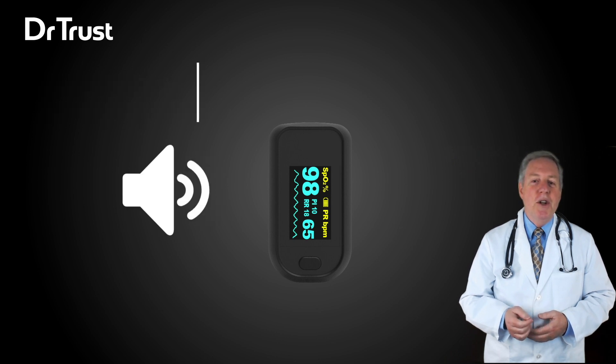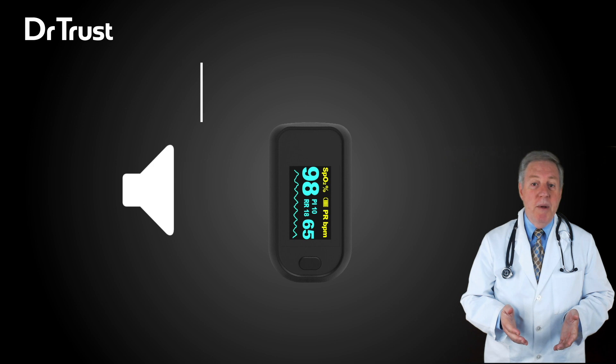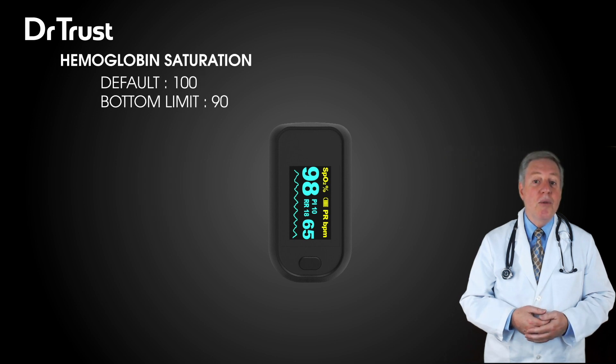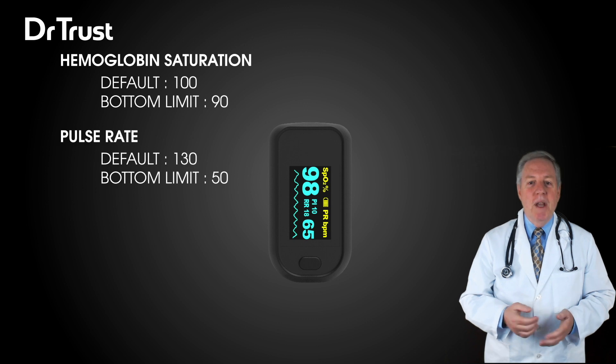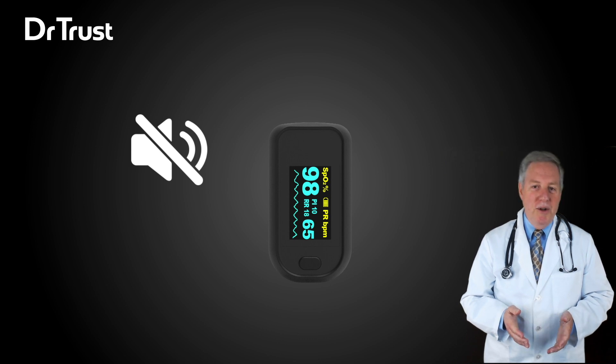It includes a visual alarm function for real-time spot checks. The default upper limit for hemoglobin saturation is 100 and the bottom limit is 90. The default limit for pulse rate is 130 and the lower limit is 50. The alarm function can be turned on or off, and the high-low limits of the alarm function for hemoglobin saturation and pulse rate can also be changed as per the patient's requirements.